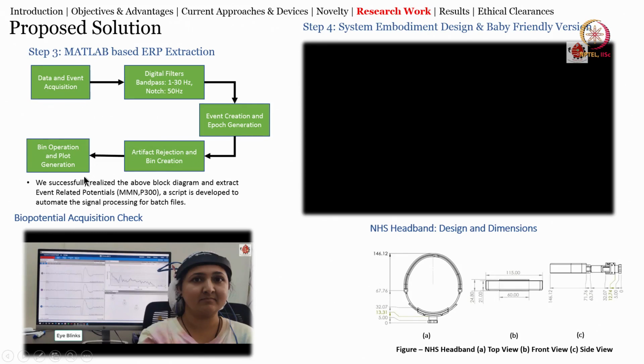Here we have successfully realized the event related potentials, MMN and P300, with a script we have designed, and this is used to automate the signal processing for batch files. Now, let us see this video.